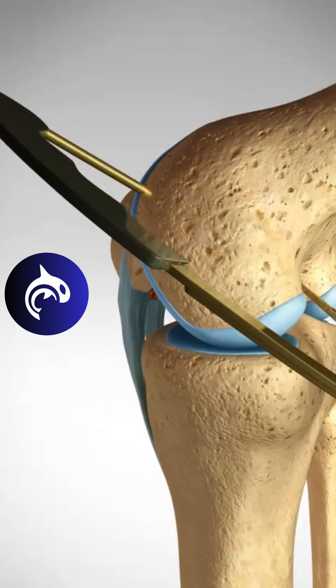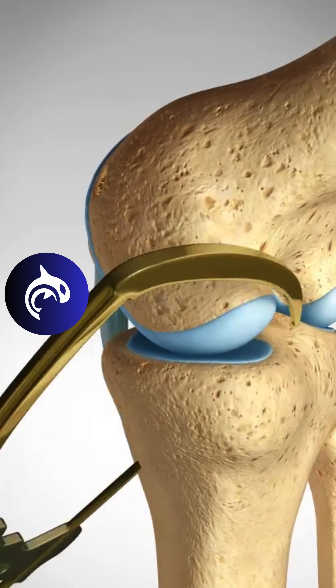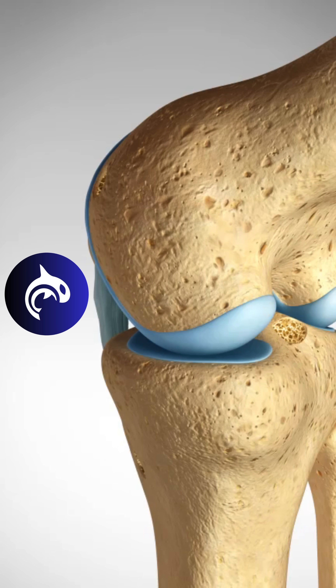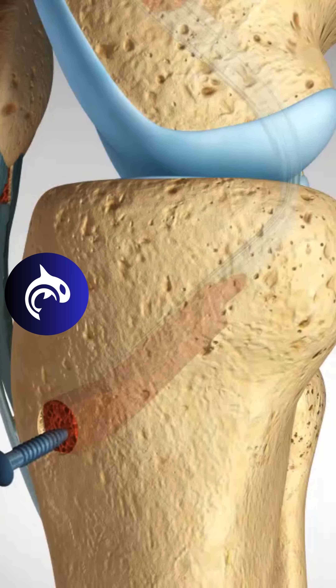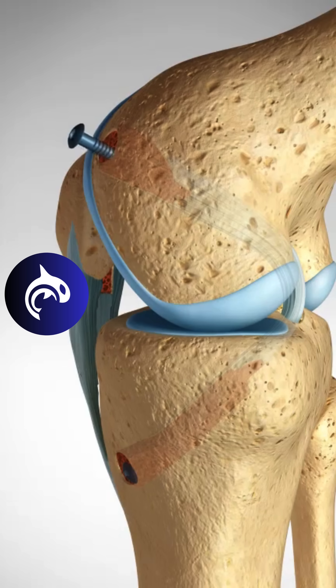Next, tunnels are created in the femur, or thigh bone, as well as the tibia, or shin bone. The patella tendon graft is carefully threaded through these tunnels, replicating the natural path of the PCL. Finally, the graft is secured with screws or fixation devices, ensuring it heals in the proper position.